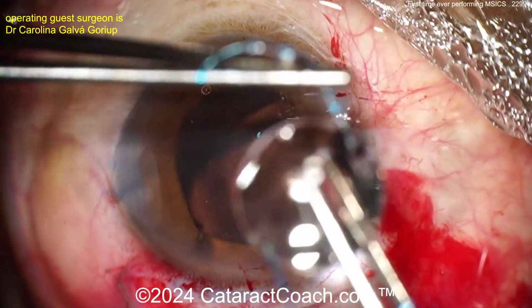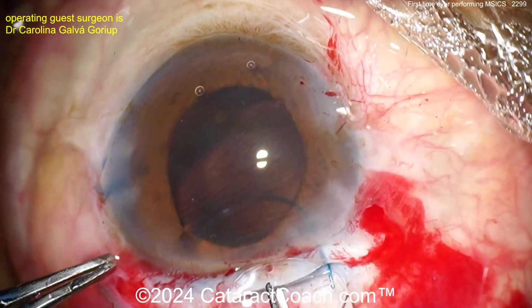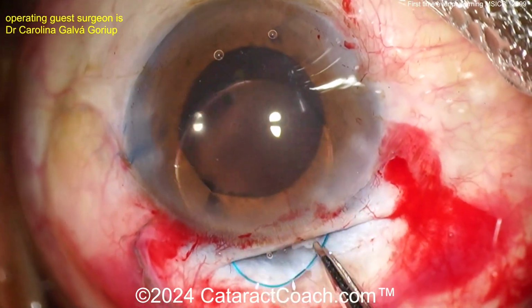Here comes the new lens. A 3-piece design is great. Just put that in there, go right in the bag. You can put a single piece in the bag too. But the nice thing with the 3-piece is if it ends up in the sulcus, that's okay too. It's a sulcus appropriate lens.